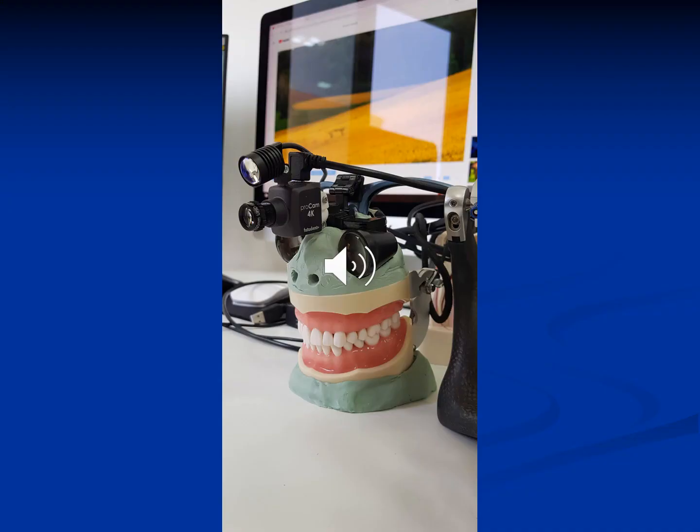Now, to summarize things, articulators are an integral part of prosthodontic work. They have different types. They differ in their sophistication and programmability. And the more sophisticated the prosthetic work that we are doing, the more sophisticated equipment that we need to use. But at the end, you are the one who is using it. It's not the articulator that's going to do the work. You or the technician is the one who is going to do the work. So if you use sophisticated equipment, you should be equipped with proper knowledge and practice to be able to use it properly. Otherwise, you might end up doing more harm than benefit to the patient or to your prosthetic work.